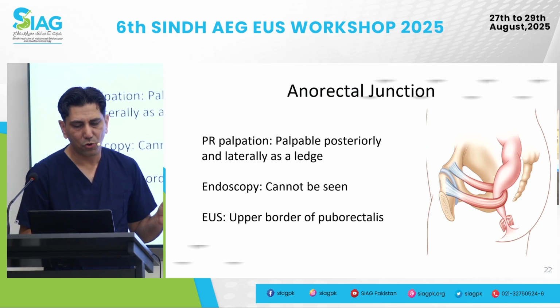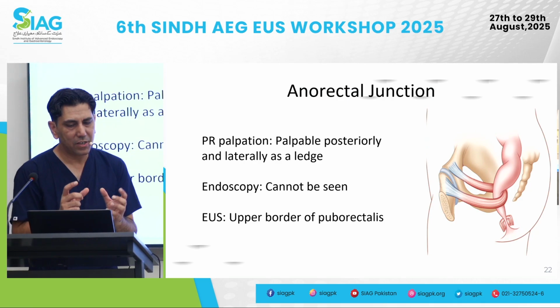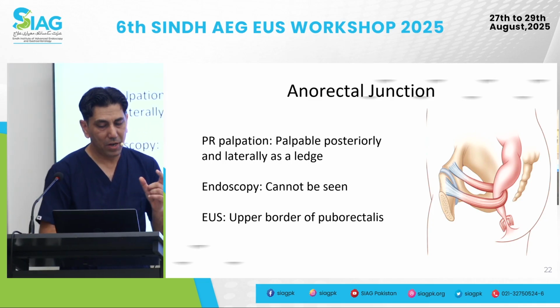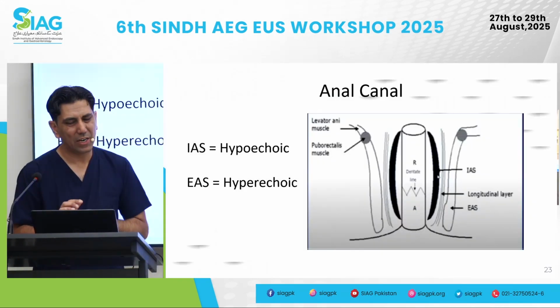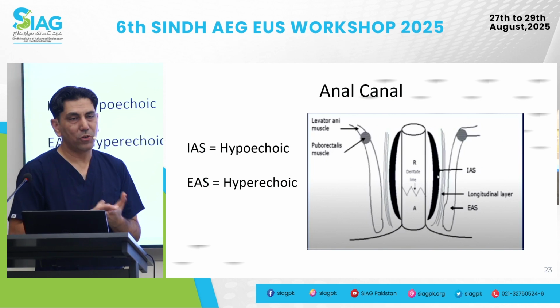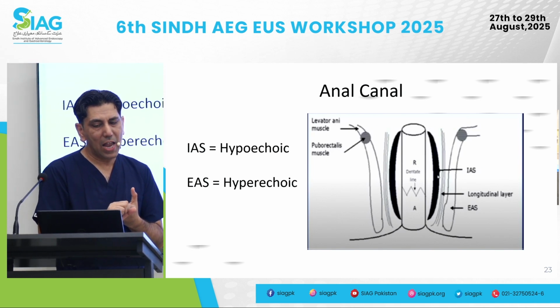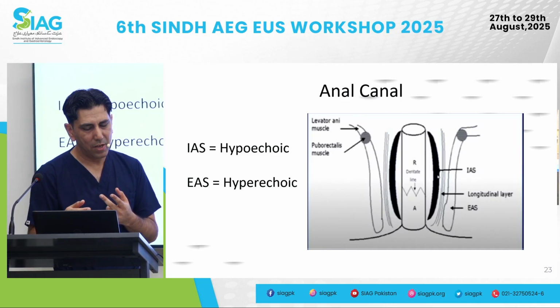Maybe the next image will show where the puborectalis muscle is. Black muscle, more thickened compared to the muscularis propria, sorry, and that's the way you can see it, but not definitively. Two areas to focus on, because they have clinical relevance, which helps us in differentiating. Hopefully the next slides will tell us.